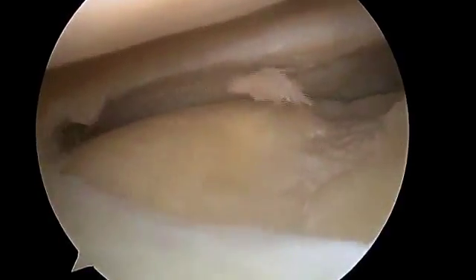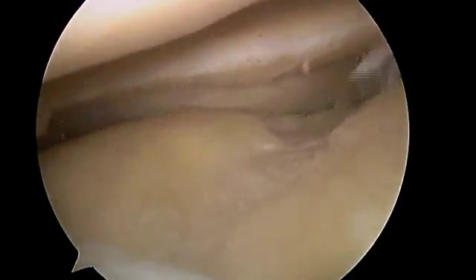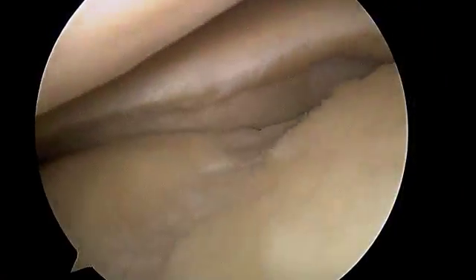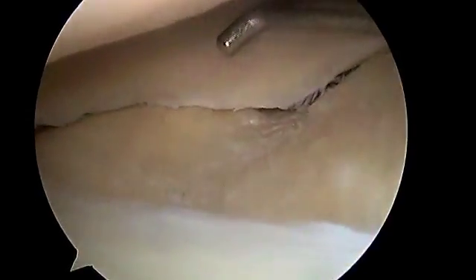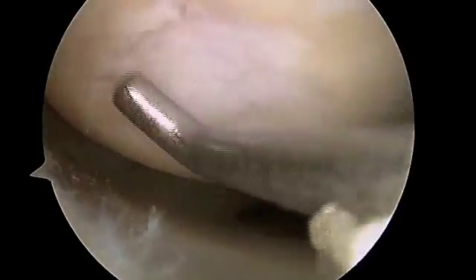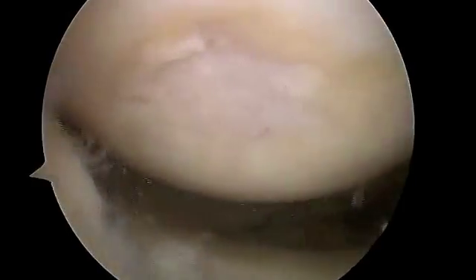Moving over to the lateral side, you can see as we pass the ACL there's a loose body that we're going to address — we get those out as we go. All those loose bodies will float around the knee and cause persistent swelling, so we get those as we go. We can see now a stable lateral meniscus and a stable tibial plateau — all the loose pieces have been addressed. The lateral femoral condyle above has also been stabilized, and no additional loose bodies will be formed.